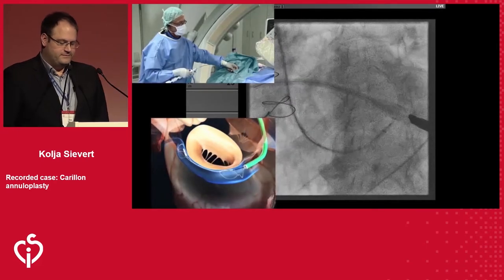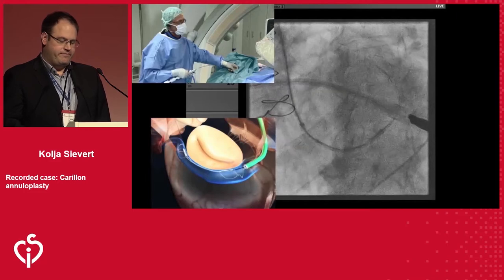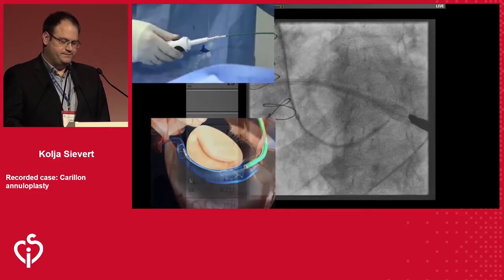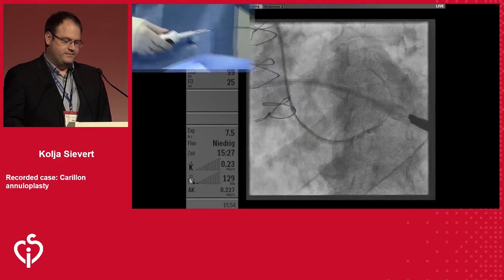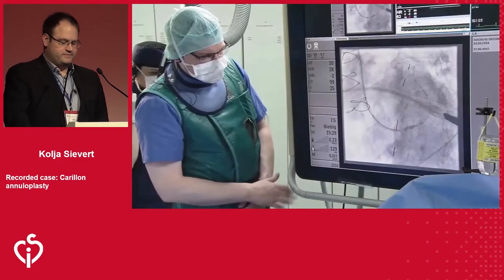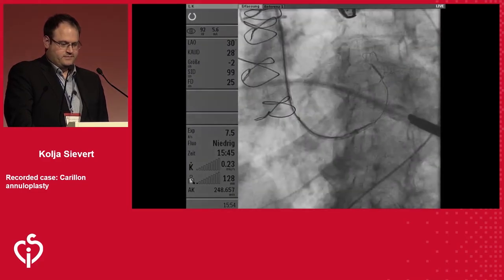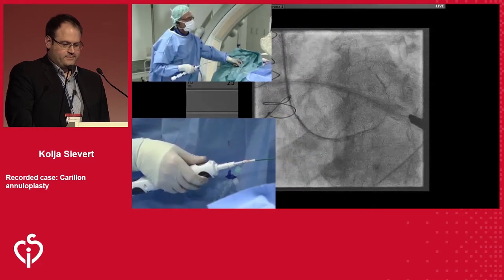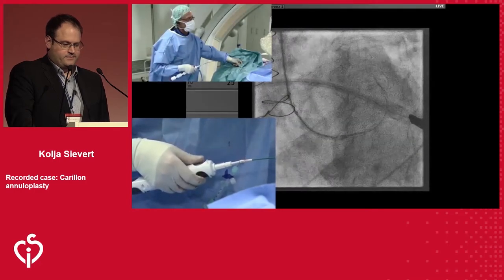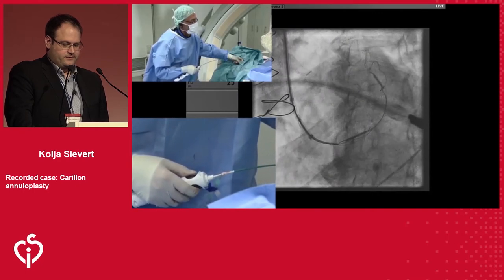Yeah, as you see too, there's a pretty significant change in the shape of the vein. So we're affecting the anatomy in a significant way with the tension. So the proximal crimp tube has maybe another centimeter until we're at maximum tension. That looks good to me. So I'm keeping that tension now, because we've reached the mechanical stop of the knob there.